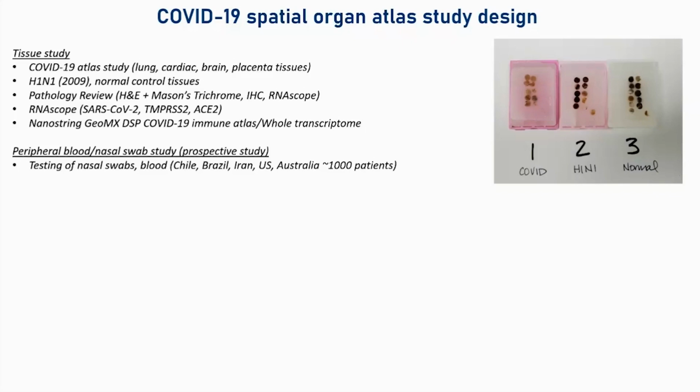So an example is on the right there: 10 patient samples, core biopsies of the lungs, H1N1. And we try to match these as much as possible for age, gender, and so on, and normal as well. And so we had these pathology annotated by local pathologists at the time in Australia, sort of mid-2020. We didn't really have a caseload, and so none of the pathologists had seen COVID-19 lungs at the time, but they were in touch with the literature.